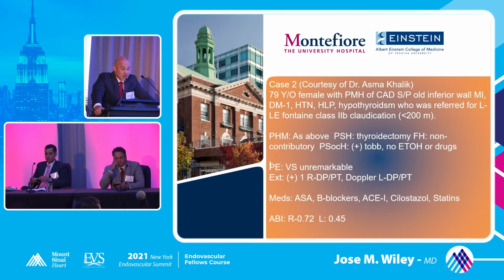So this is a second case. This is courtesy of Dr. Asma Khalik, who is an outstanding peripheral interventionist who trained under Prakash, and she's now an attending at Lenox Hill. This is a 79-year-old female with past medical history of coronary disease, status post myocardial infarction, diabetes, hypertension, hyperlipidemia, and hypothyroidism, who was referred once again for left lower extremity Fontaine class 2B claudication.